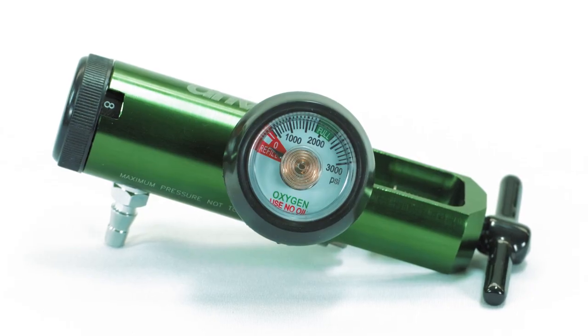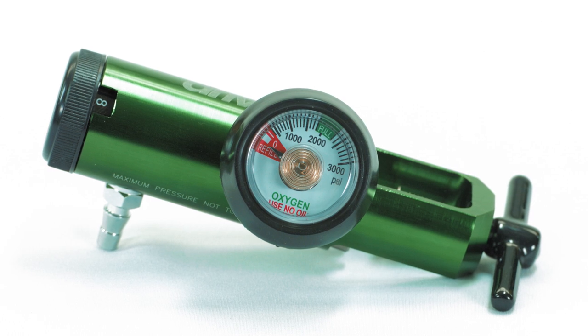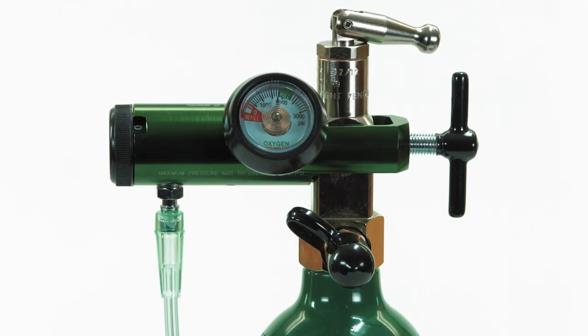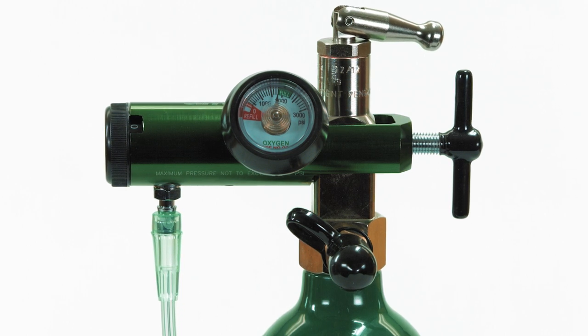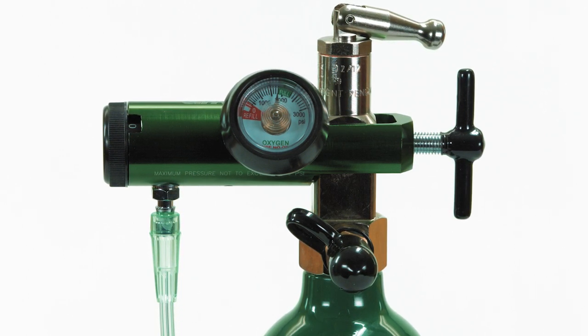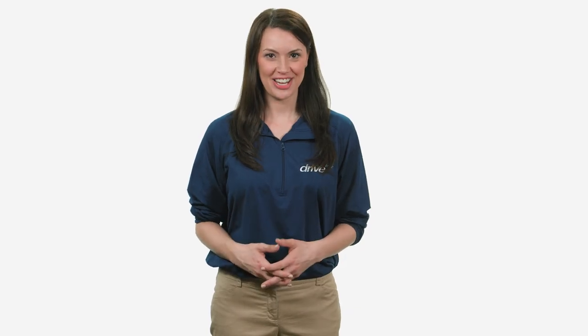Oxygen regulators are designed to administer a set flow of supplemental oxygen as prescribed by your physician because you're not receiving enough oxygen from room air alone. Drive Medical offers a variety of regulators. Your equipment provider will determine the best regulator for your needs. Let's go through the major parts of your regulator.